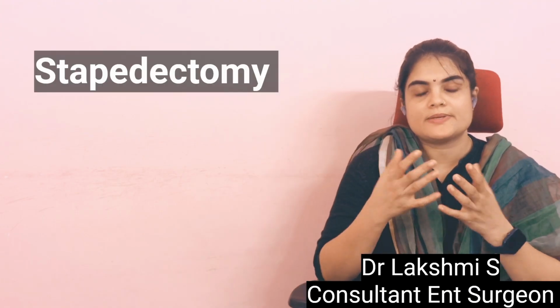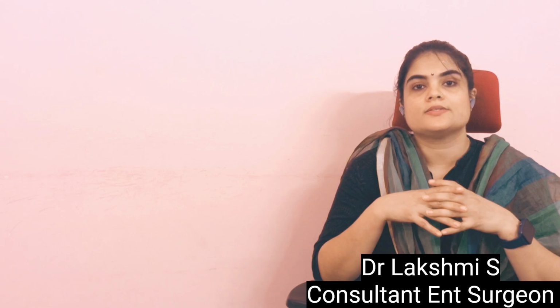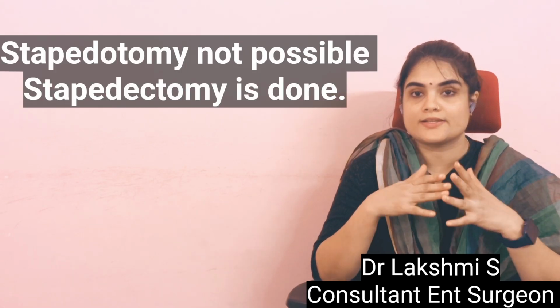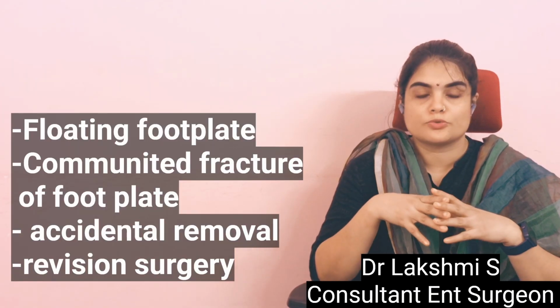What is stapedectomy? It is partial or complete removal of the footplate. The posterior part of the footplate is removed. It is also known as large fenestration surgery. It is usually done when there is any floating footplate, any fracture of the footplate, or inadvertent removal of the footplate while we are removing the superstructure.